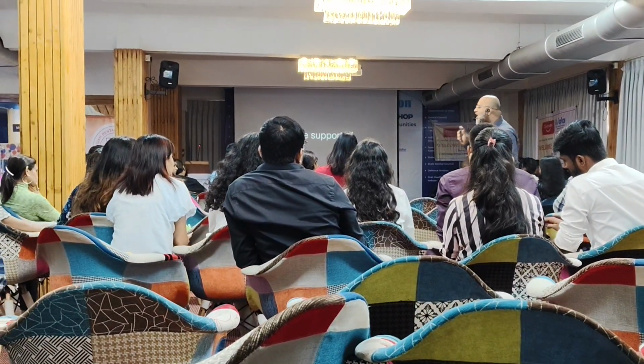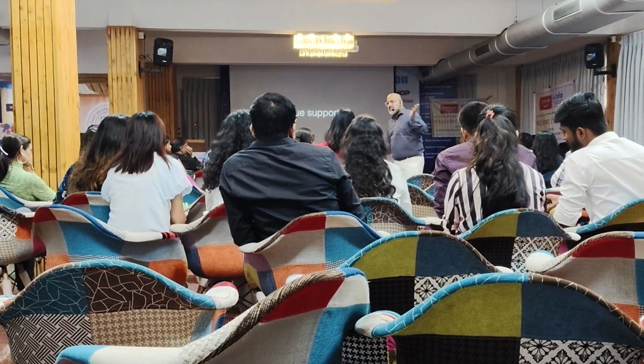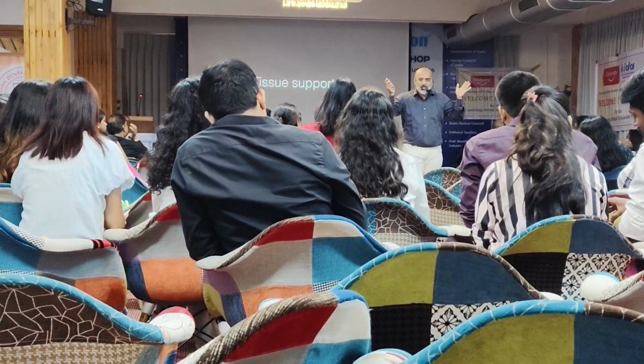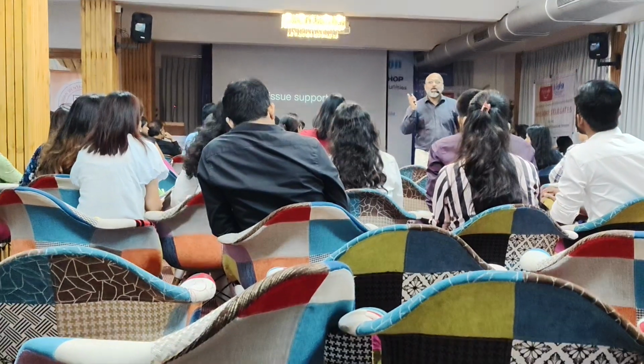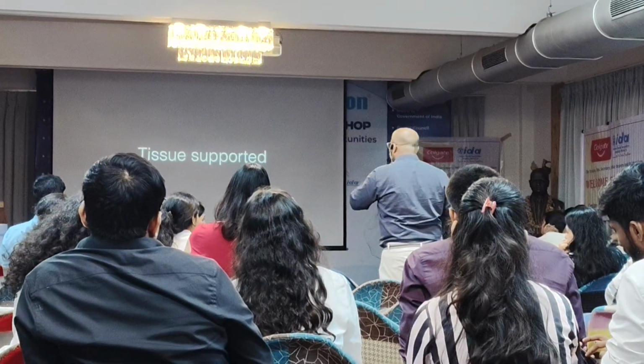Can that be a starting landmark for you guys? You just see an edentulous bone on a CBCT. No, right? You need to plan a denture first. You need to understand where your implants are going to be placed. Moving ahead, you need to plan your implants.